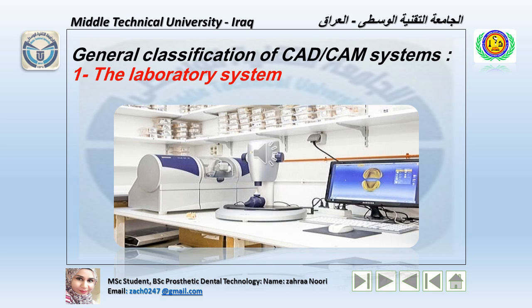This system has several advantages: automated steps for all fixed restorative fabrication, high accuracy, and less chance for error compared to the traditional technique. The scanned image is transferred directly to the laboratory from the office, which reduces chairside time, and there is also a team approach to fixed restoration.